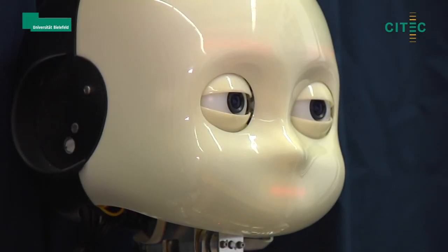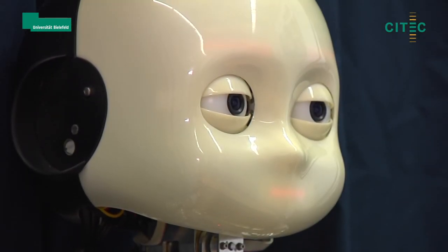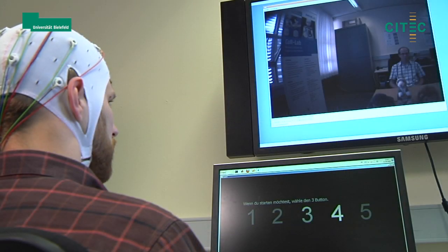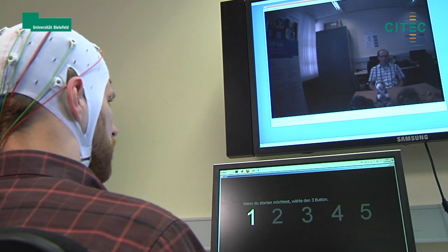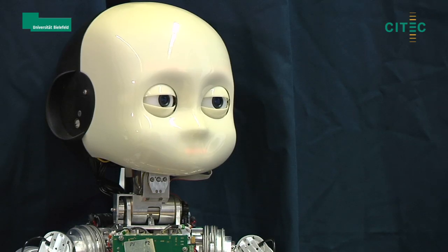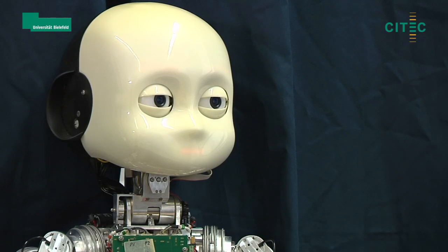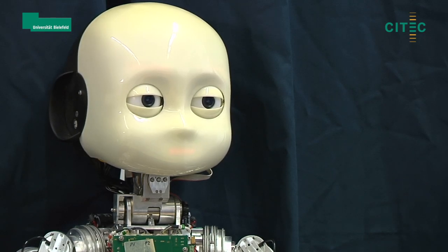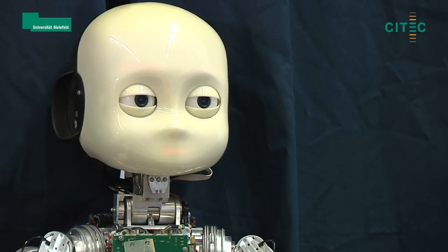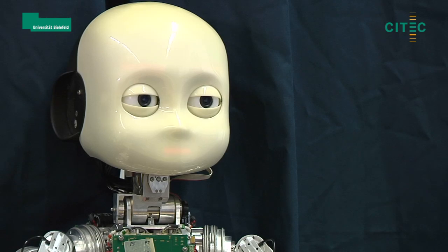The iCup robot has two cameras in his eyes. Their image is presented to the handicapped person on a screen. The person may turn the head of the iCup to the left or right by using a specific mental strategy called motor imagery. This allows the person to look around without the need to move his own head.